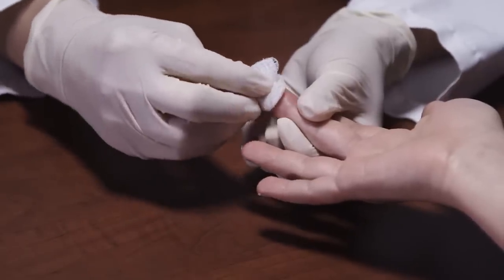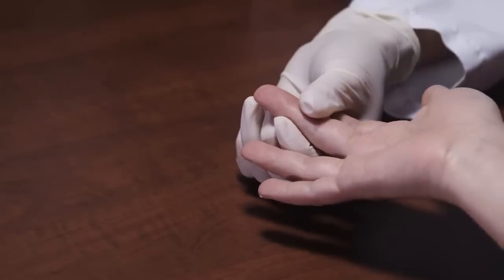For cholesterol testing, wipe away the first drop of blood with gauze and generate a second drop.